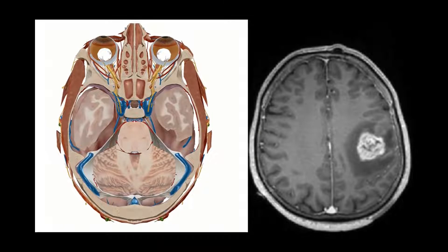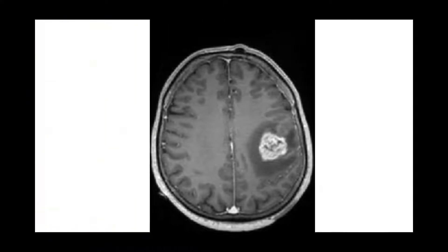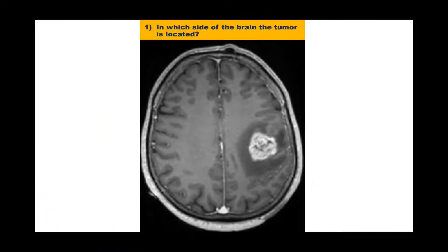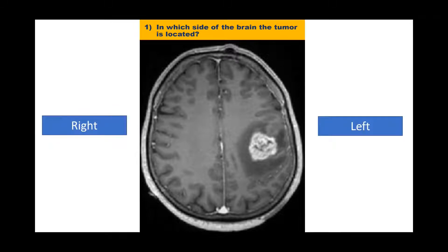Now, we can see in our CT scan and answer the first question. In which side of the brain is the tumor located? Now, it's easy to say that it is on the left side.